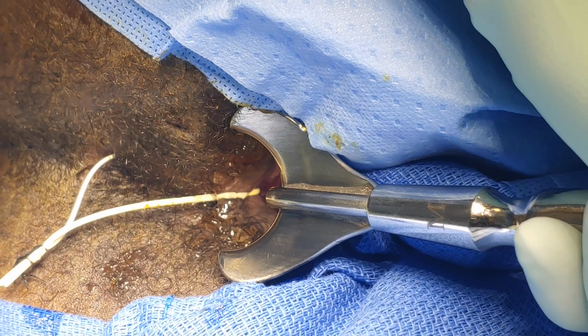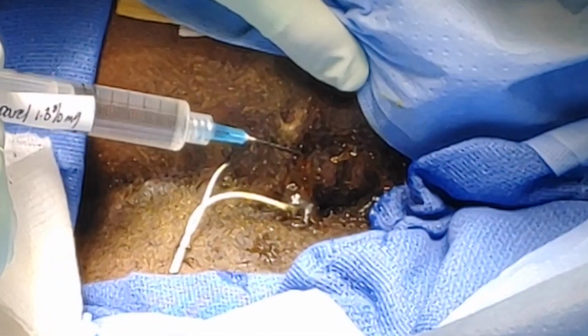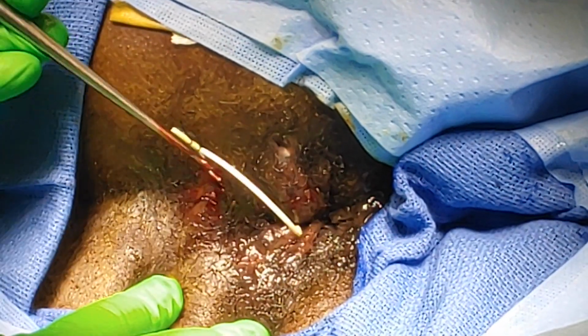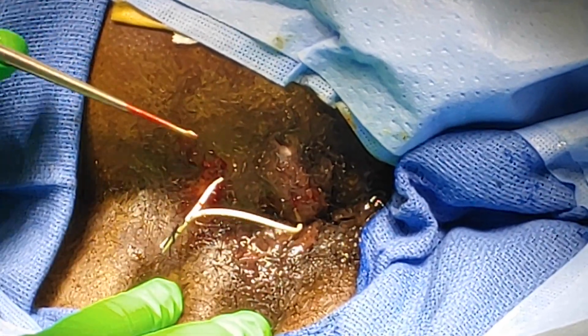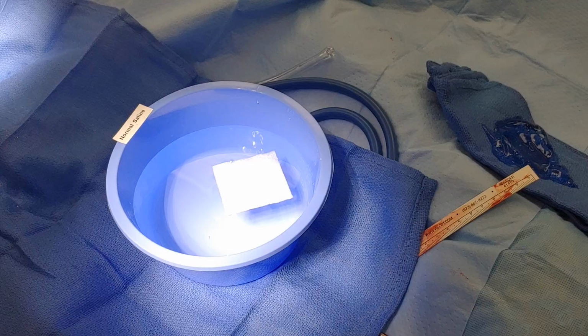After positioning the patient in left lateral decubitus, the operative area is prepped and draped, and the fistula is exposed, visible here in the right posterior perianal soft tissue, just adjacent to the midline. A circumferential perianal block is applied with a mixture of lidocaine and bupivacaine. The fistula tract is then aggressively debrided with a curette to ensure complete removal of epithelial tissue lining the lumen of the fistula. The length of the tract is estimated.